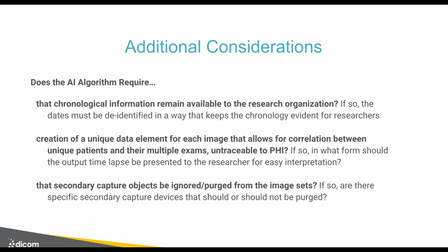So again, the design of the de-identification process is where you need to decide, with us, before we start de-identifying, what is the intent for the data? How are they going to be used? And what is going to constitute usable data by the researchers? Well put. Other considerations: we touched a little bit on excluding secondary capture objects, for example, the scanned paperwork, and indicating if there's a correlation for time lapse, etc., which we were just discussing.